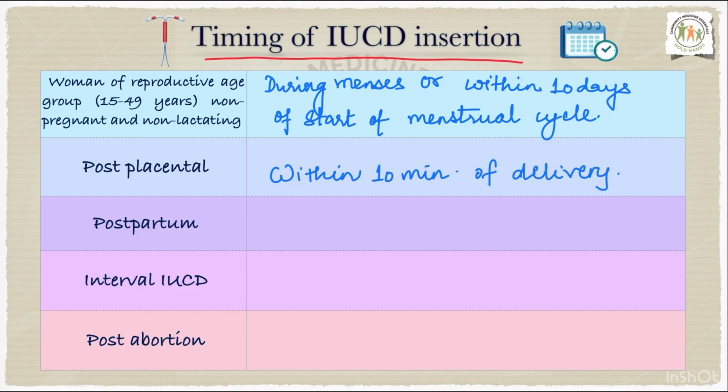Postpartum insertion is within 48 hours of vaginal delivery.